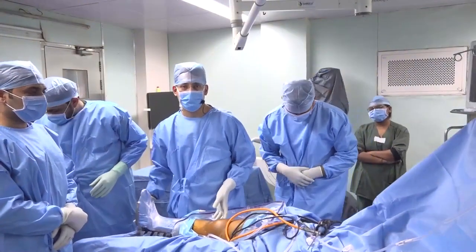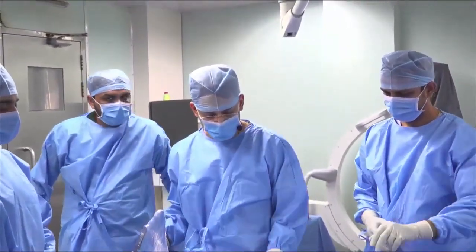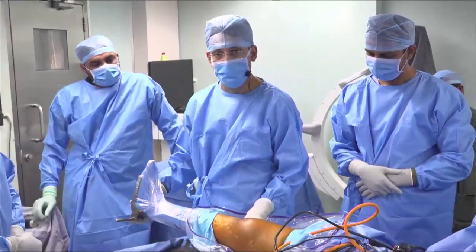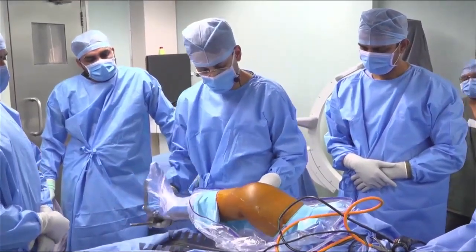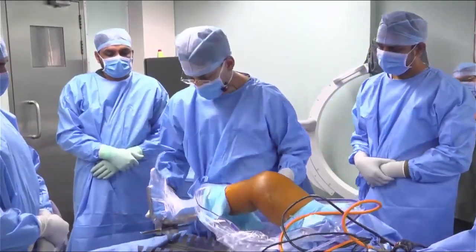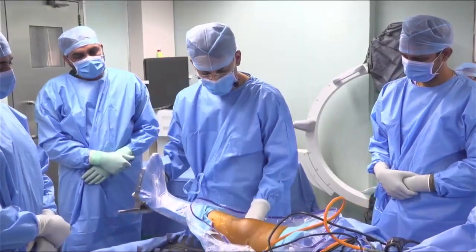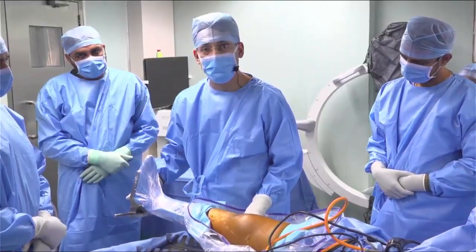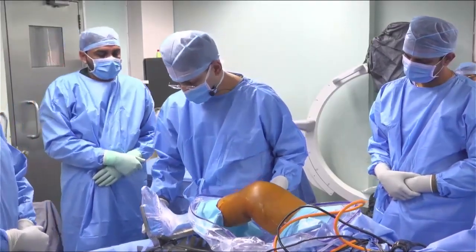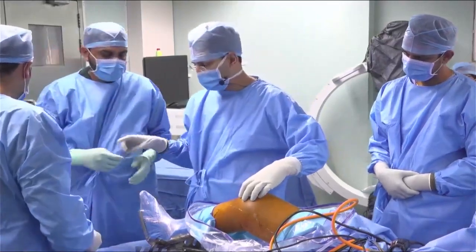Everybody, this is a patient who presented to us almost 7 days after a knee injury during an RTA. You can see that this is a very unstable knee, and there is a total opening of the MCL, almost like 40-degree opening of the MCL in full extension as well as the mid flexion. So grossly unstable knee. Predominantly it's a very unstable MCL, and you can see a little bit of posterior and anterior sag as well. So this is almost a KD3 kind of injury. Gross instability, the whole of the MCL is opening, and this also coincides with the features that we have seen on the MRI scan.